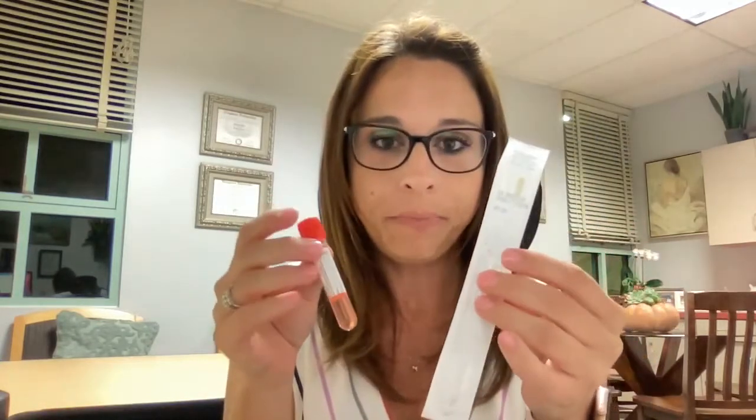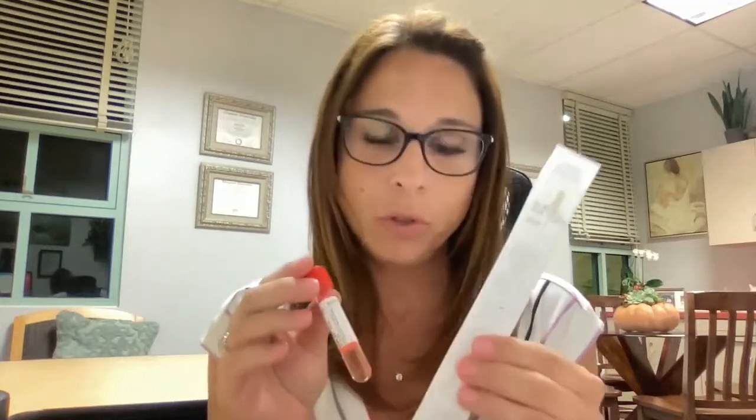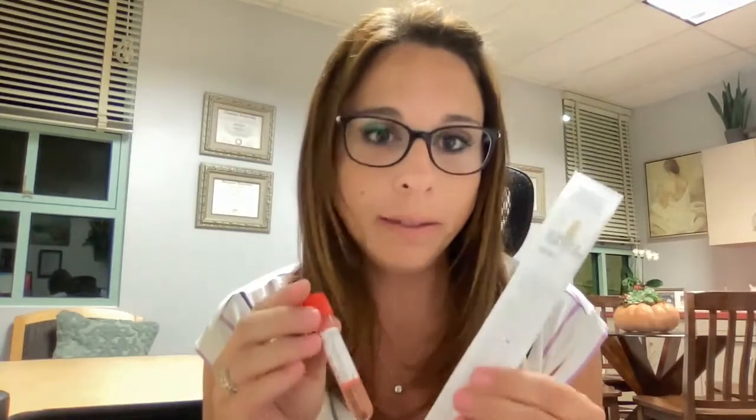You're going to be able to test yourself. You're going to be given a tube and a swab. The swab is no bigger than a pencil — it's like a Q-tip. It's super quick, super easy. There will be a medical staff member available to help you with the testing if you need it. So a little weird, but I'm actually going to do the test on myself so you can see this.